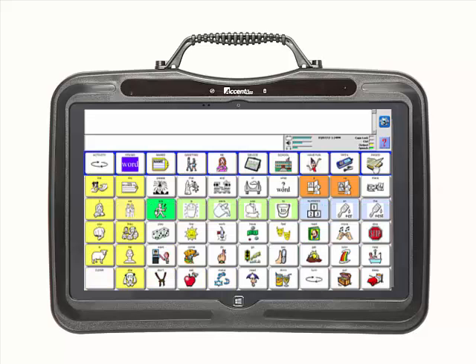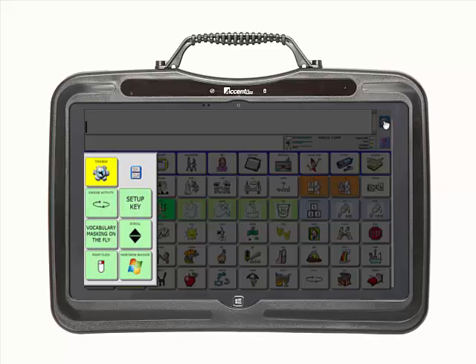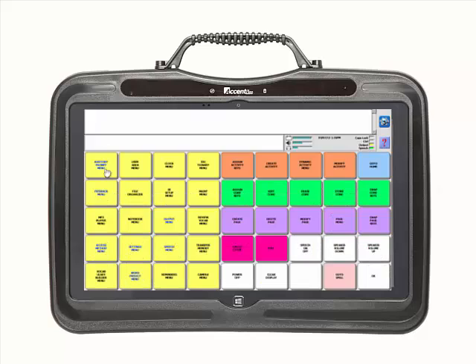The second way to enter the toolbox is to select the gray wheel that appears in the upper right-hand corner of the software. Select the gray wheel. Locate and select the yellow toolbox key in the top row of the drop-down keys. You are now in the toolbox. To exit the toolbox, use the light blue Go to Home key in the top right-hand corner of the screen.